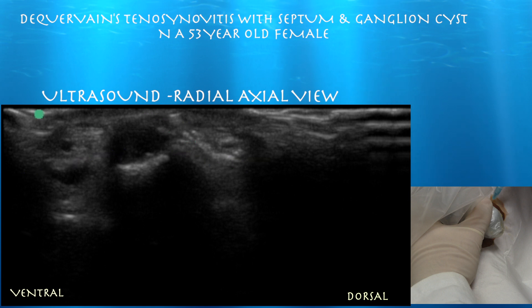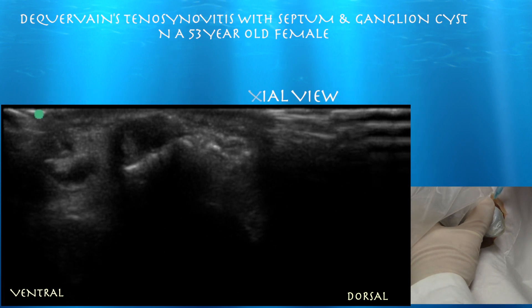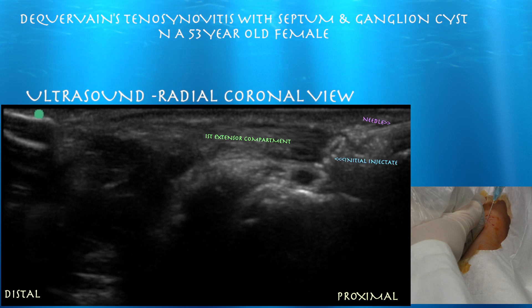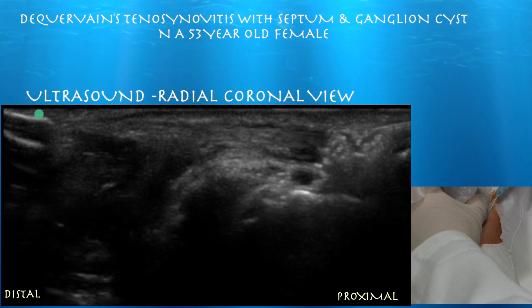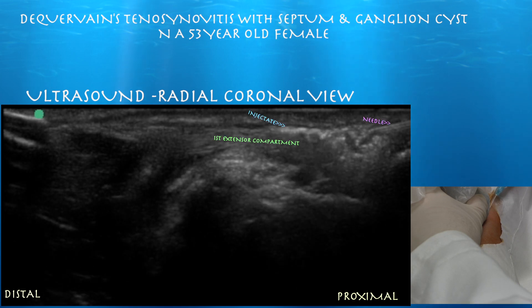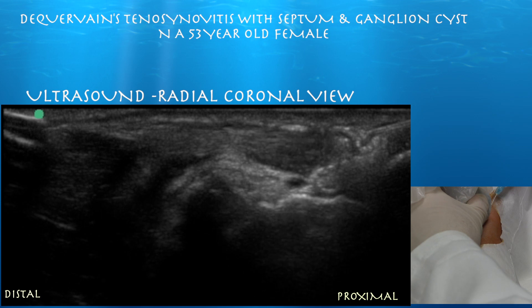You don't see the tendons in the first extensor compartment secondary to anisotropy. We went ahead and injected more cortisone with the needle in long axis, and you can see it sitting just superficial to the first extensor tendons within the tendon sheath. As we start to inject, you'll see it spread distally. Here's the injectate spreading distally along the tendons, confirming we're within the tendon sheath. We're at the very edge of the sheath and you can actually see it spread circumferentially around the tendons.